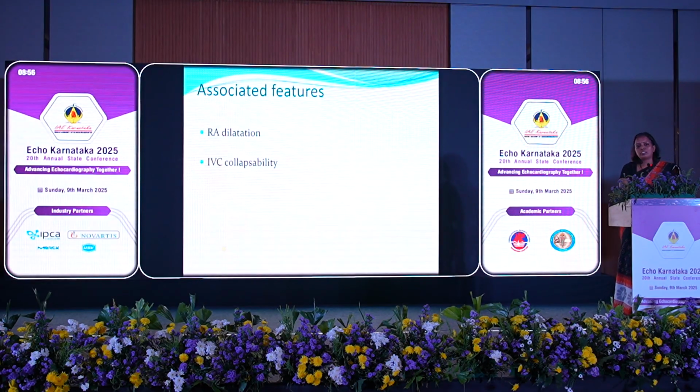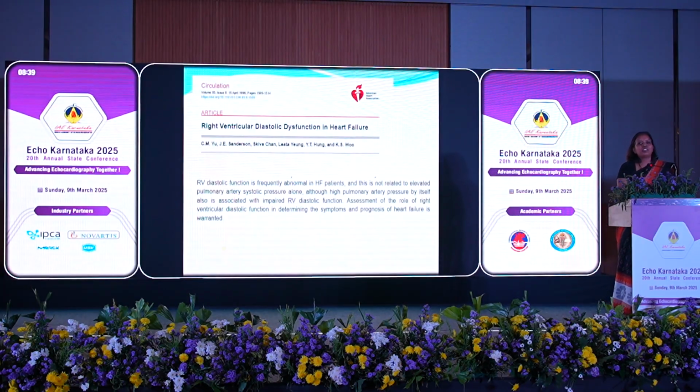And always look for associated features; friends are known by their associations. The associated features of RV diastolic dysfunction are RA dilatation and IVC collapsibility that we routinely assess. Now we know how to assess RV diastolic dysfunction. Why should we do it?